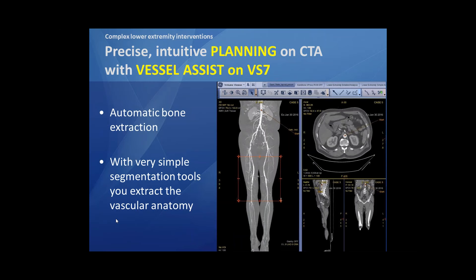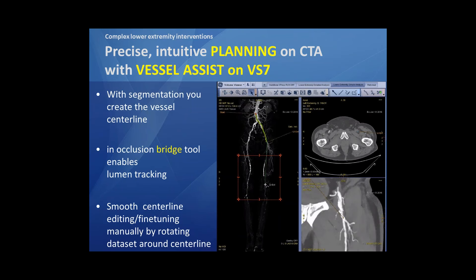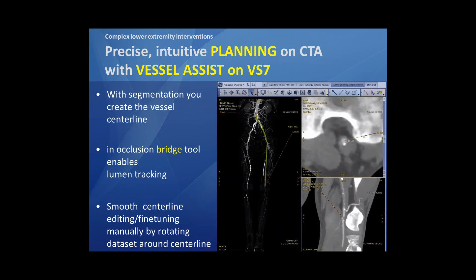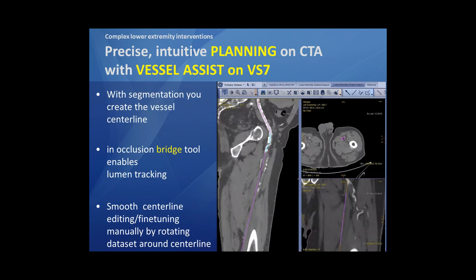Afterwards, when you have this vascular anatomy, you can in an easy way create the vessel central line using the segmentation. I start with a little dot in the aorta and then afterwards I go with a little dot to the groin, and you see that the green line is really central-lining the iliac axis. Then, in occlusions — long occlusions such as an SFA occlusion — we can bridge the occlusion of the SFA from the beginning point in the groin up to the reentry zone at the popliteal side. This enables lumen tracking.